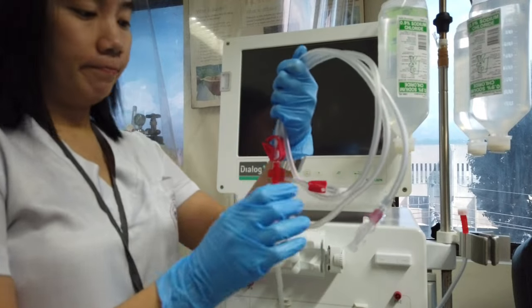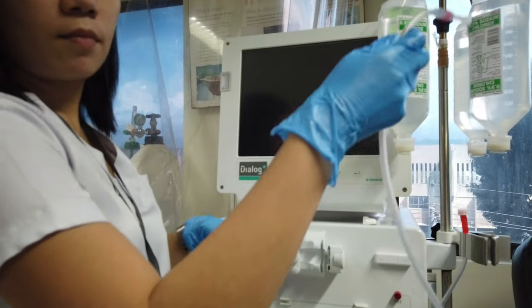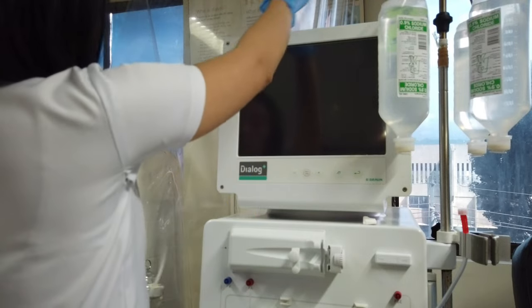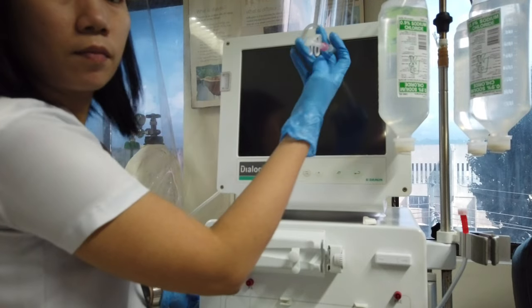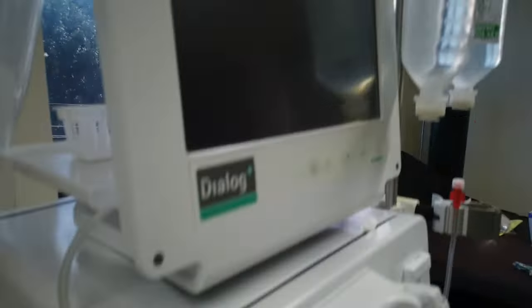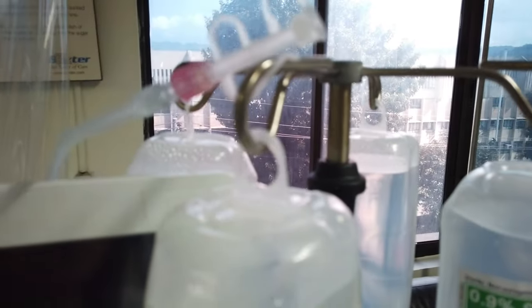Then you're left with the patient's end line. It should be this long, since this will be the one you will hook to the patient. Place the patient's end somewhere it can hold on to, and don't forget the extra line to clip as well. I secured it this way to avoid it from falling.